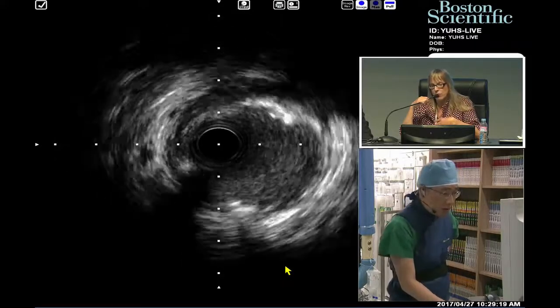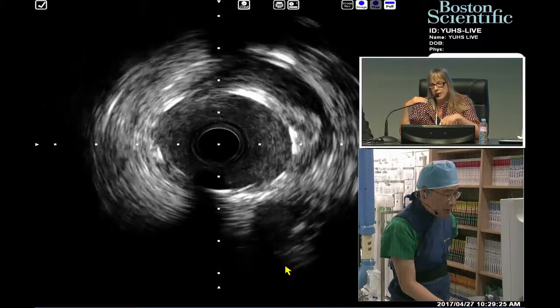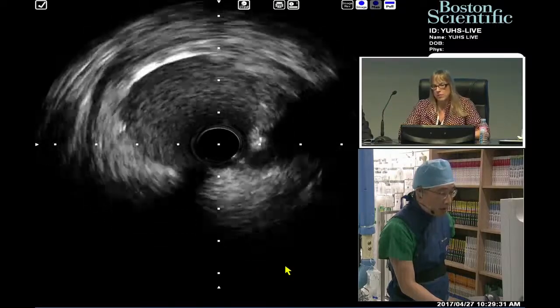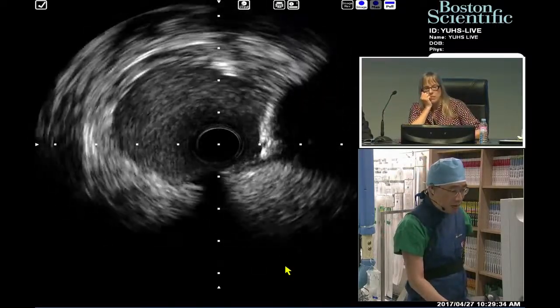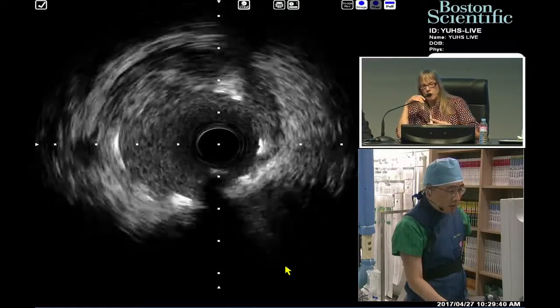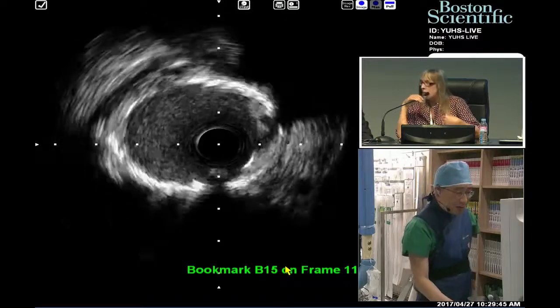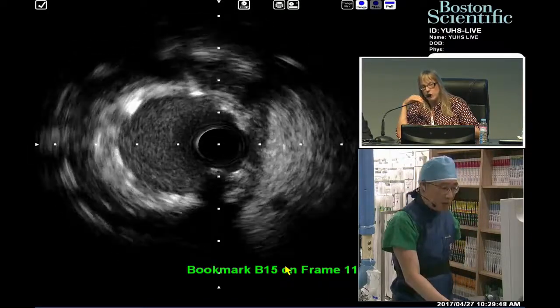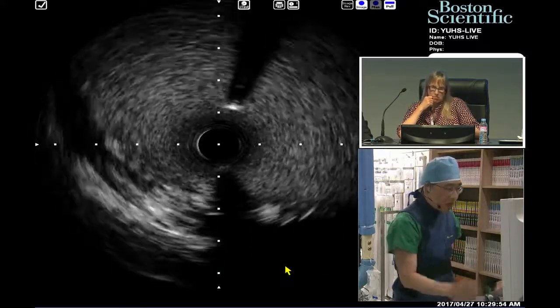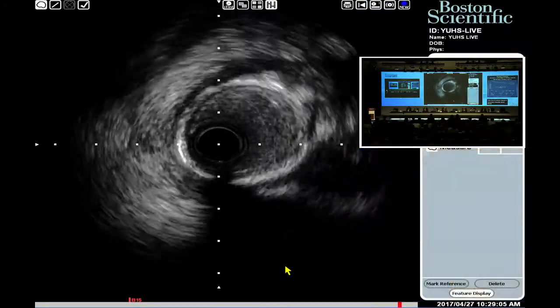We see there is a lot of distal stent edge remodeling, a lot of plaque burden. And for me, it would also be important to see the proximal reference segment in the left main to make that decision. Yep, the stent is around diameter 3.5. For me, the same. Because in the end, we don't want to treat the plaque. We want to make sure that we have a smooth lumen transition from proximal to distal. So the circumflex ostium is well opened, which is important. Around 5 o'clock is already passed, and there is no dissection. Based on the IVUS finding, we have to deploy an additional stent for the ostium of the left main.